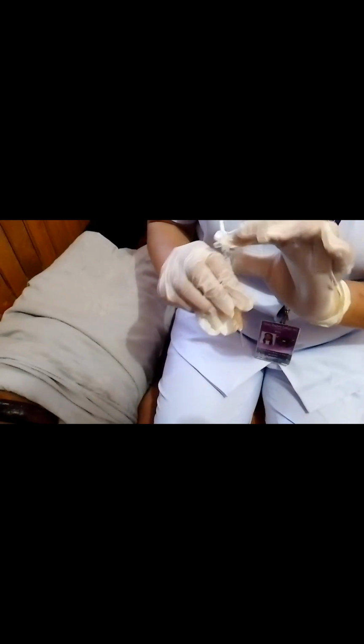And now pull off the needle cap and hold the syringe between the thumb and the four fingers of the dominant hand as if you're holding a dart. Now insert the needle quickly at a 45 to 90-degree angle. Pain is minimized when inserting the needle without hesitation.